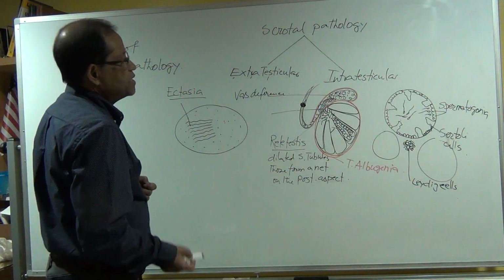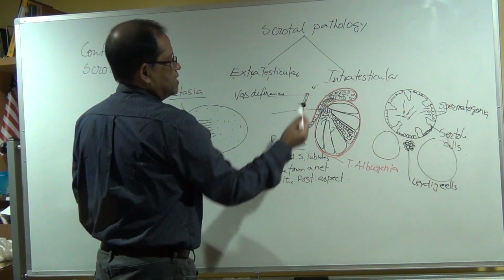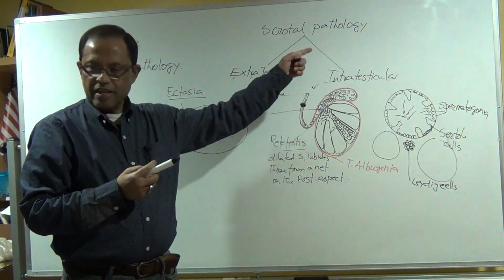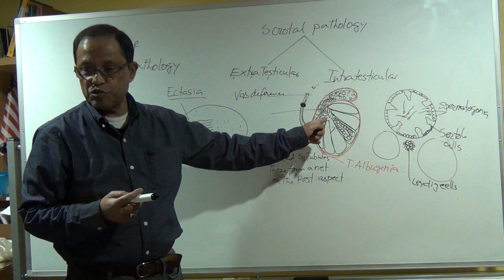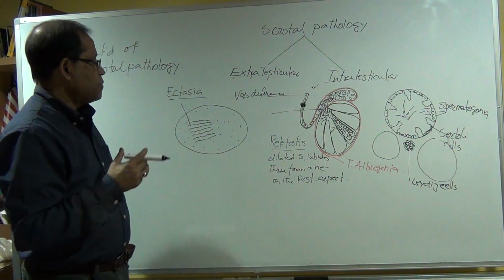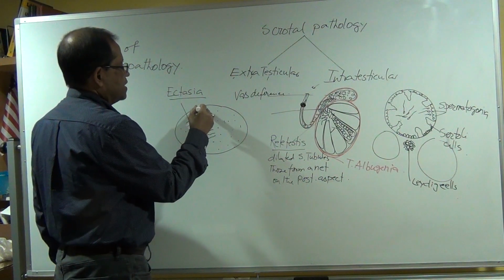Due to the vasectomy, this part is absent and tight. Sperm is being produced, but that sperm cannot pass through. As a result, there is a backup, and because of the backup, there is dilatation of the tubules. Not only dilatation, sometimes you might see a cystic area.